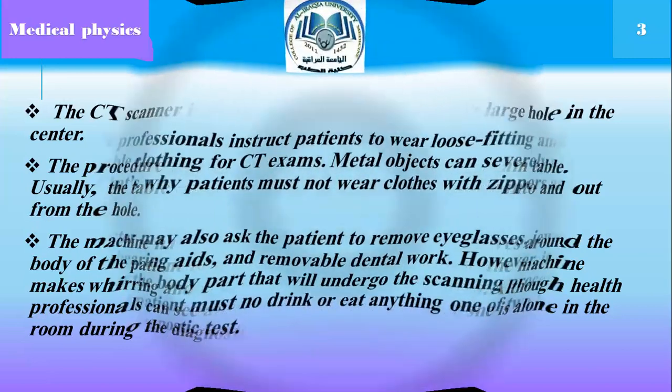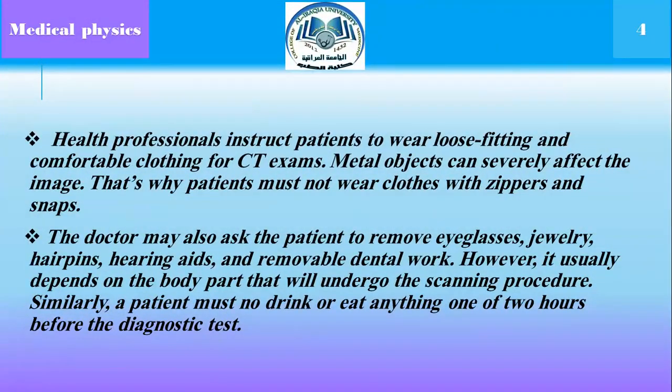Health professionals instruct patients to wear loose fitting and comfortable clothing for CT exams. Metal objects can severely affect the image. That's why patients must not wear clothes with zipper and snaps.